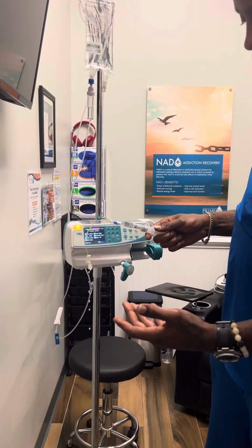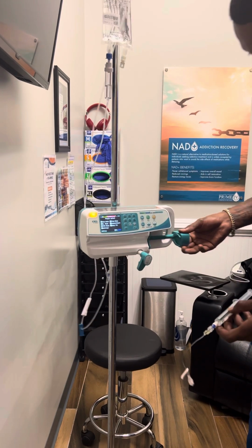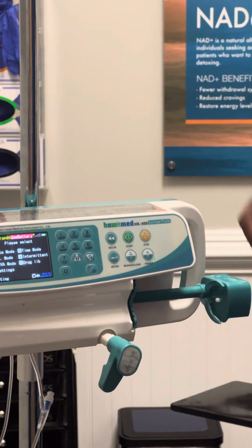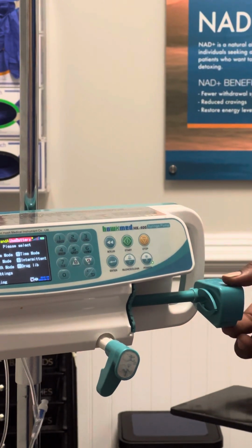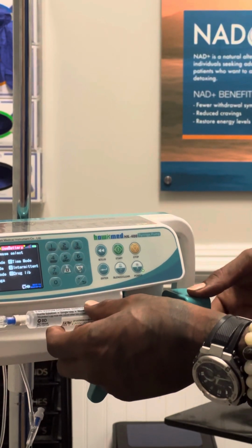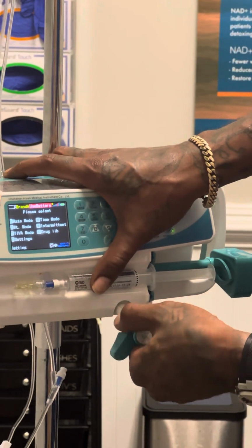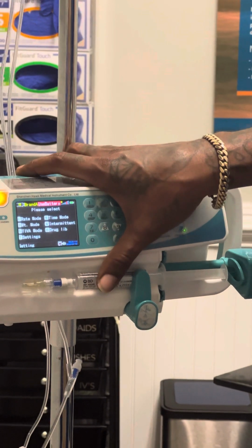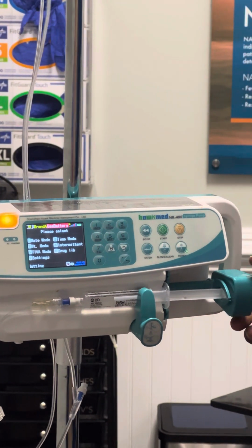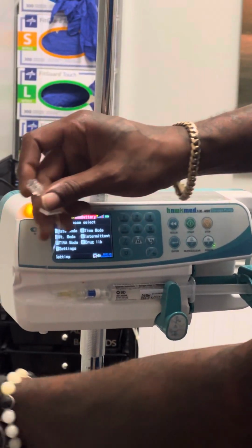In this case, we're using a 10 cc pre-filled syringe. We're acting like we have vitamins in it. This adjusts with a button on the bottom, in and out. Sometimes it'll lock out like that, but there's a white button you can press to reset it. All right, so this slides in and out. You'll see where the notch of the syringe will fit into this compartment here. This you just pull out and twist, and it should secure the syringe in place. This should be adjusted so that it's touching the back of your plunger of the syringe, all right? And then we would just connect this to the port that we've chosen.